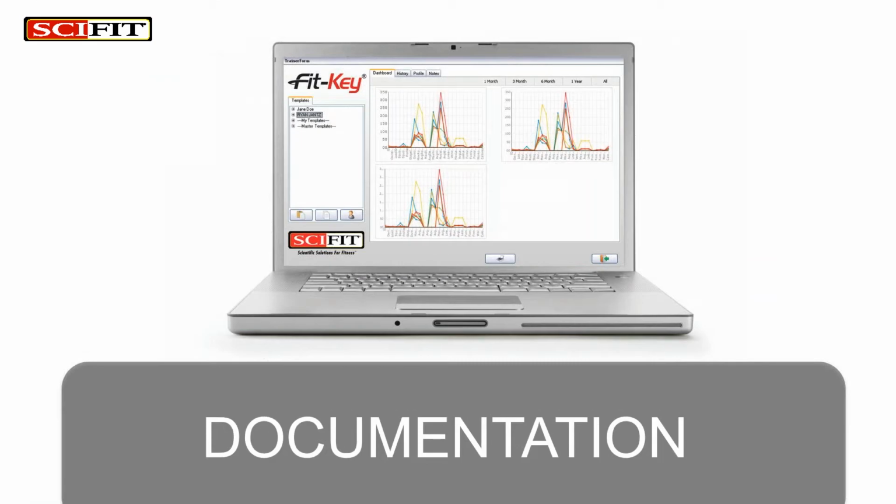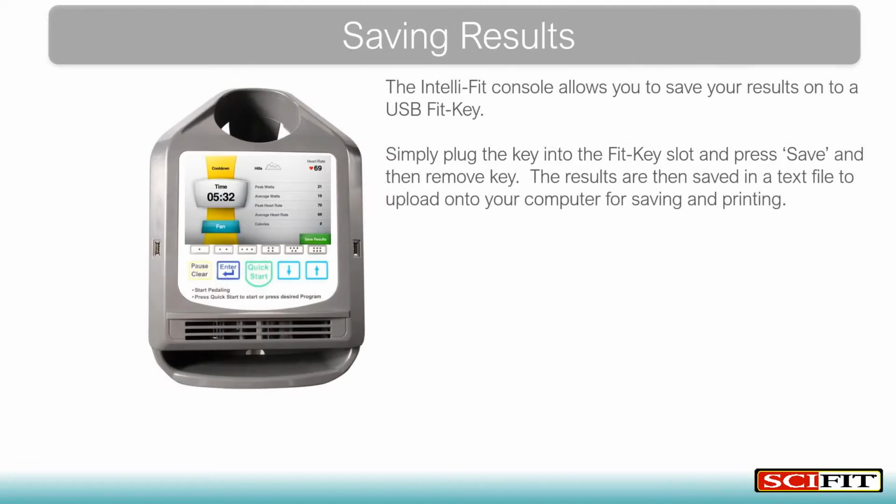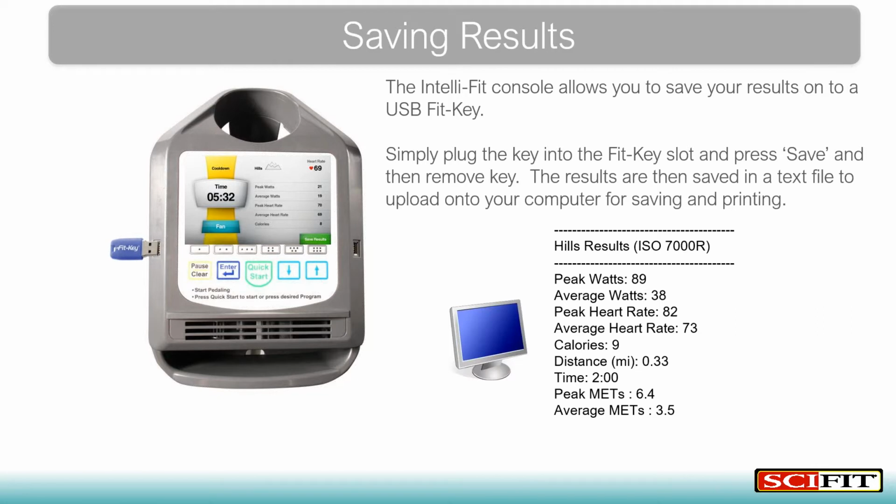Now we're going to talk about a couple ways you can record exercise results and outcomes. At the end of an exercise session, the workout results can be saved by plugging in a USB flash drive in the left side port on the console, and then pressing the green Save button, which is in the lower right side of the cooldown screen. From there, the information can be uploaded to a computer in the form of a text file for tracking progress.